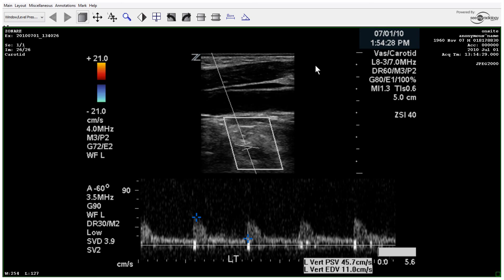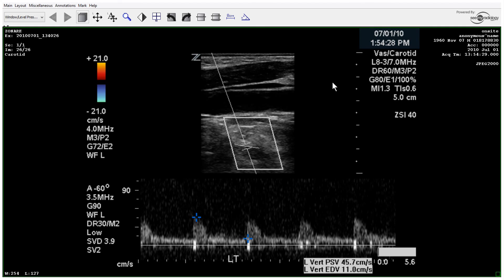There's the vertebral and it's antegrade. So we can conclude that there's a normal carotid exam on the left and a totally occluded right internal carotid artery, as evidenced by 2D color and spectral Doppler. Those are the key points you'll want to look for in performing a carotid exam, particularly when you have a suspicion of a total occlusion.